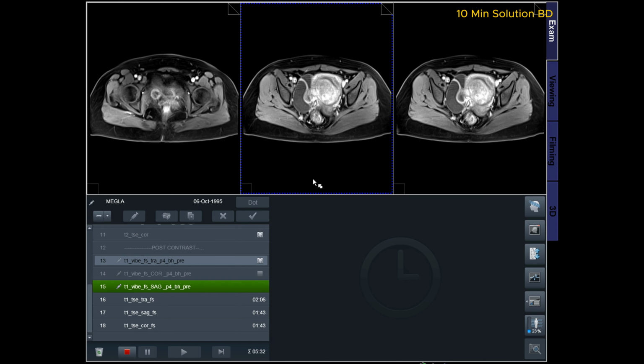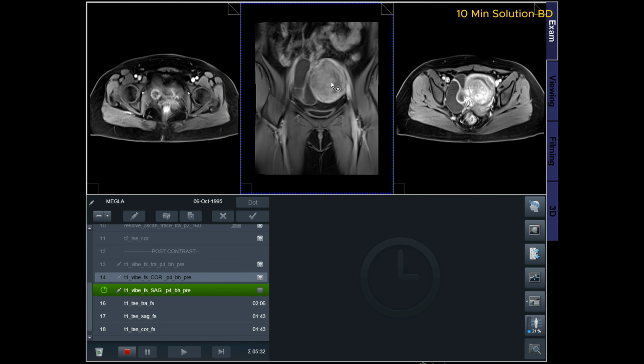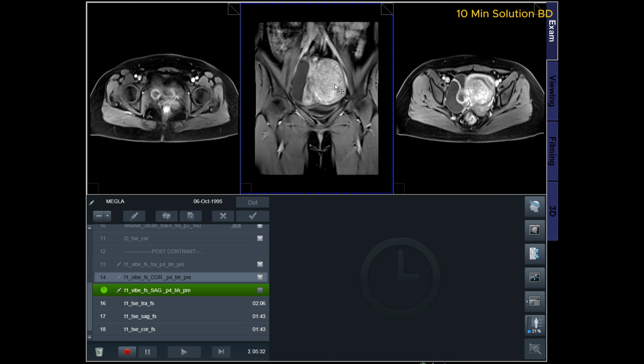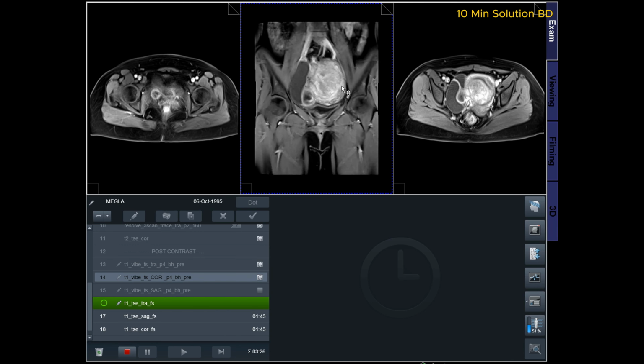Claustrophobic patients may be accompanied into the scanner room, e.g. by staff member or relative, with proper safety screening. Offer earplugs or headphones, possibly with music, for extra comfort. Explain the procedure to the patient and answer questions. Note down the weight of the patient.